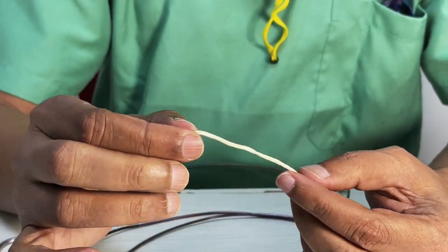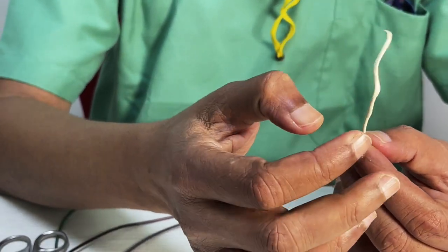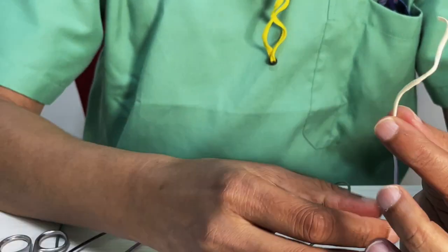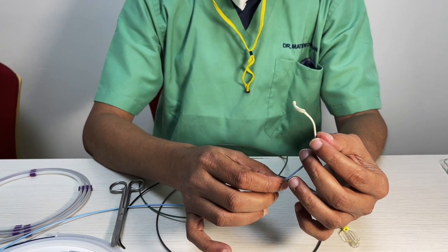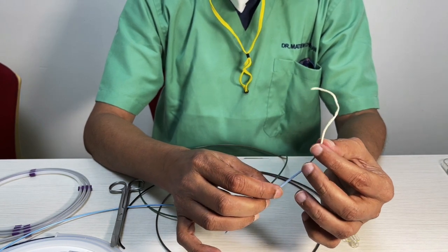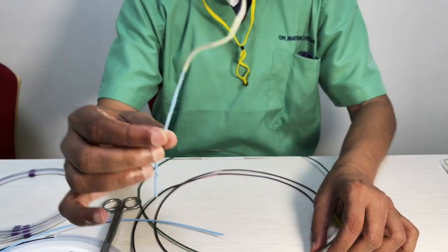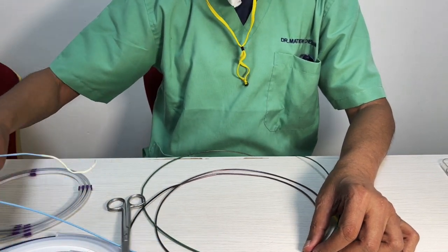But the braiding is there, and the braiding has a big problem that it gets completely kinked. Can you see that? It's completely flat. So the problem of the guiding catheter was it was useful to a certain point of time. Even today, you can use it if you do not want to go beyond the petrous segment. Thus came a set of catheters that would completely revolutionize the way we were working.